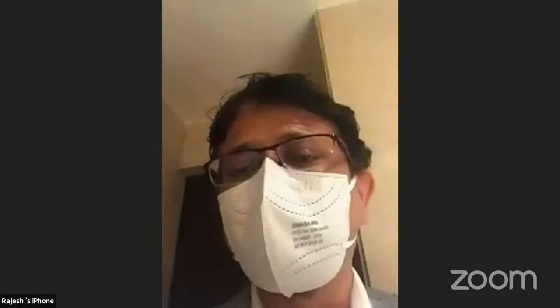Intraoperative OCT? Yes. Actually, in lamellar keratoplasty, iOCT is really very useful. For a posterior lamellar keratoplasty, let me first tell you, when you do a DSAEK procedure, when you have implanted the lenticule and injected air, you get to know whether fluid is there between the donor lenticule and the cornea or not. If there's no fluid, this means that's the end point. You don't have to inject more air and wait for some time so that the lenticule is there, and then you can reduce the amount of air.